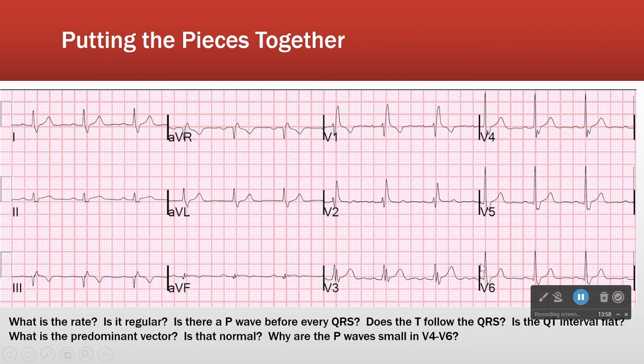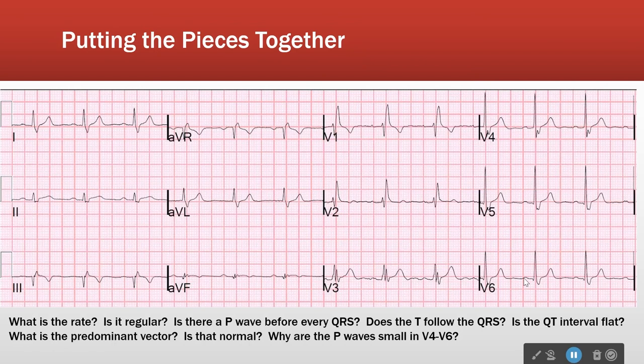All right, so let's look at what an EKG is. This is what somebody will hand you, or what the machine will spit out. We've talked about all these pieces, so let's look at how they're arranged. Each of these areas, from the black line to the black line, are the tracings from different leads. So this is the tracing from lead one, and after the black line, this is the tracing from AVR. After the next black line, this is the tracing from V1, V4, and so on.